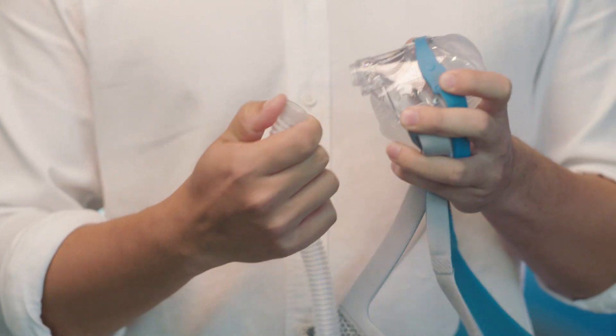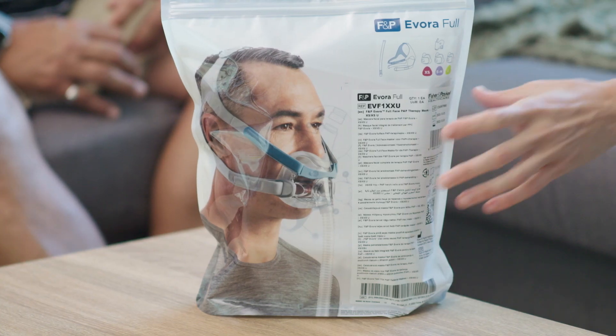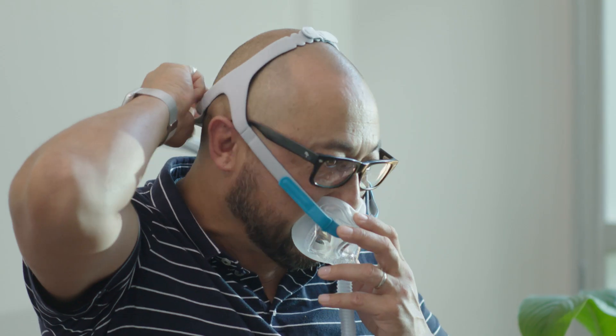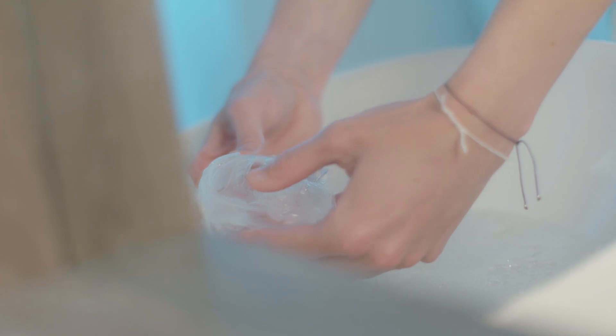We're always trying to find the absolute limits in how users would use the mask. In the usability lab, we go through how to disconnect and connect the mask, how to clean it, how to set up the headgear in the easiest way, and how they can put it on themselves — showing the ease of use.